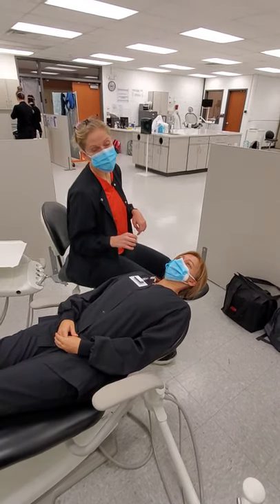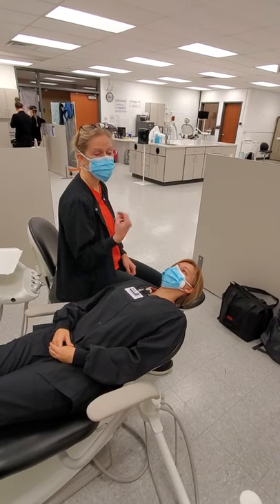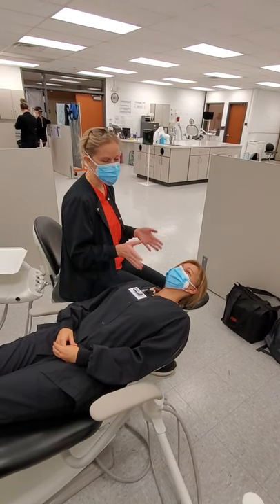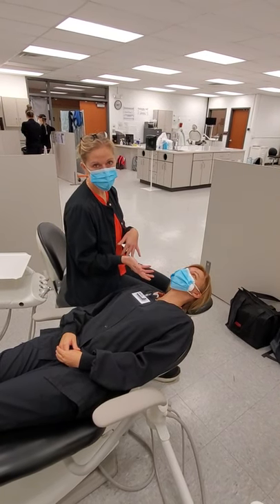I'll be at the 8 o'clock position for the anterior maxillary and mandibular towards me, and then for maxillary chin up, chin down for mandibular.